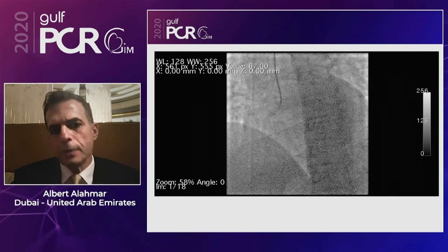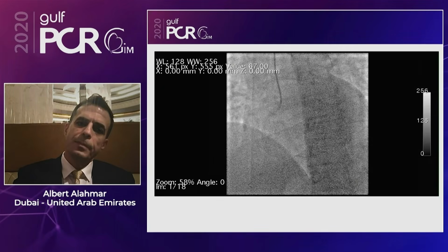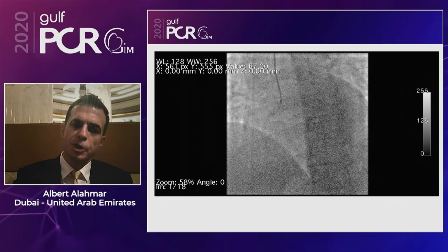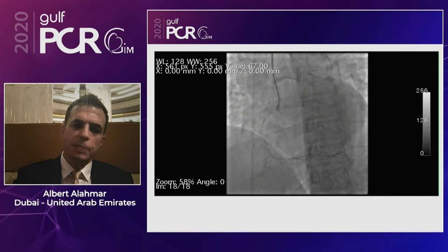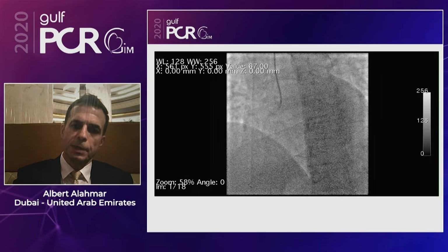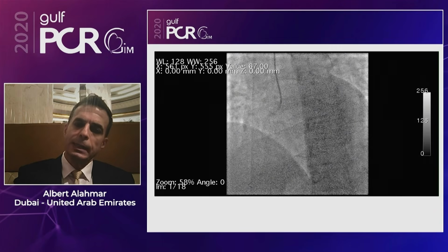The procedure went successfully. We stented his ostial right coronary artery with the guide catheter, as you could imagine. 90% of the time I was in the aorta, actually; there was no way of engaging the right, as his blood pressure would slump down to the 20s the minute I engaged my guide catheter. We stented, and it looks like a nice result.